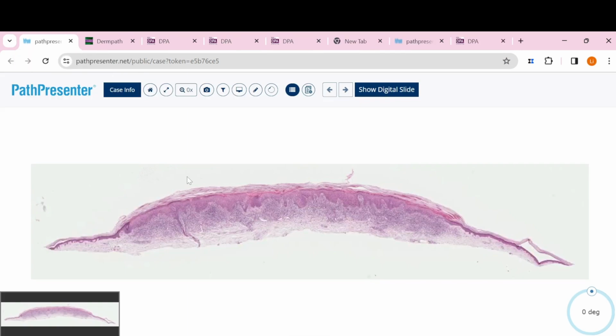Okay, this case diagnosis is lichen planus. Lichen planus clinically has multiple lesions, usually on the wrists or maybe on the extensor surface of the extremity. Lichen planus is the classic change in the lichenoid interface dermatitis chapter. So I think some people are always kind of confused about lichenoid changes. When they see tons of lymphocytes in the dermis, they will say this is lichenoid change.